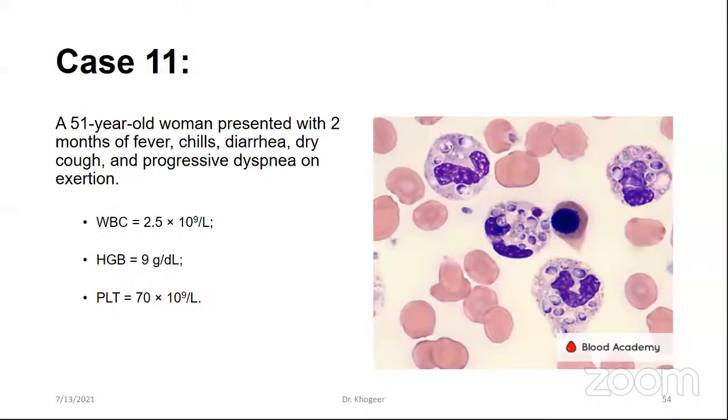This is why in the report, some pathologists use reactive/atypical lymphocyte rather than using atypical only, because it will make the clinician a little bit confused. I prefer, if you want to use reactive alone, it's fine. If you want to use atypical also, just put atypical/reactive lymphocyte. But if you want to say this is an abnormal lymphocyte, you can say atypical or abnormal atypical lymphocyte.